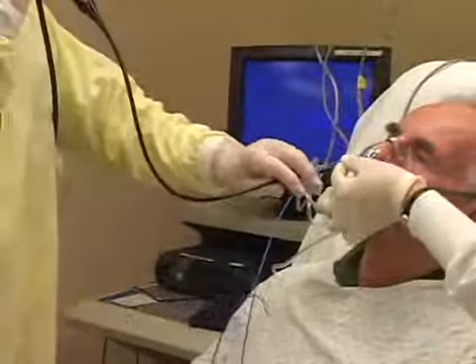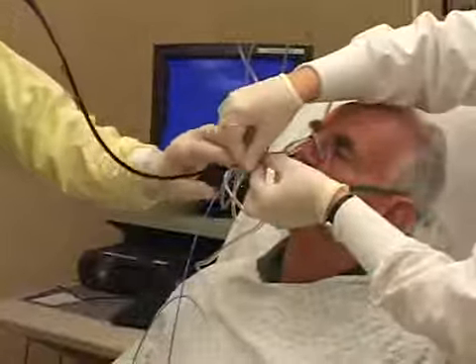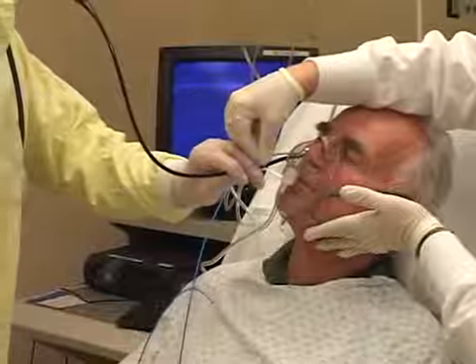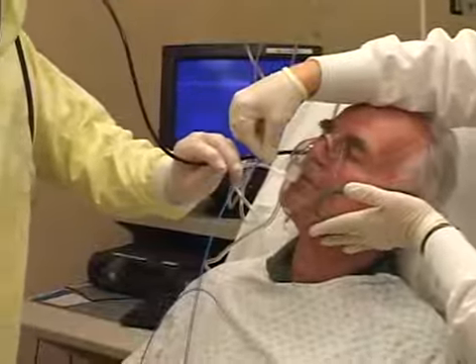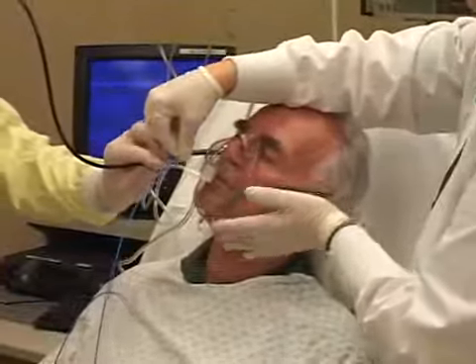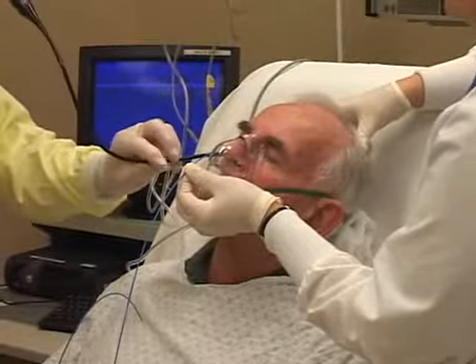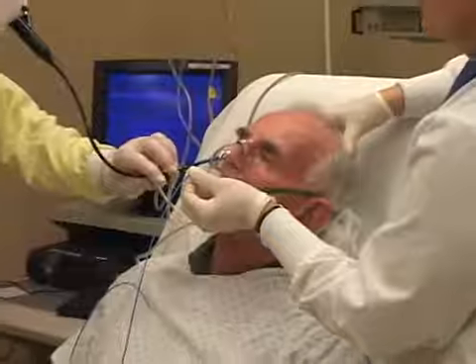The bronchoscope is then reinserted through the opposite nares and repositioned to visualize the lesion.